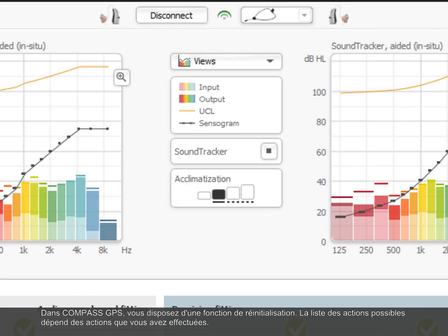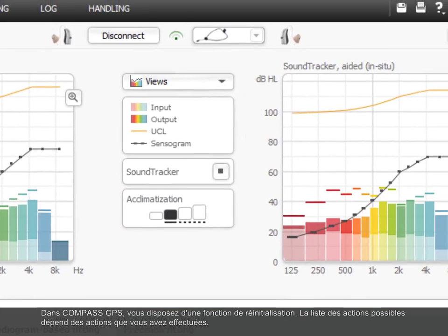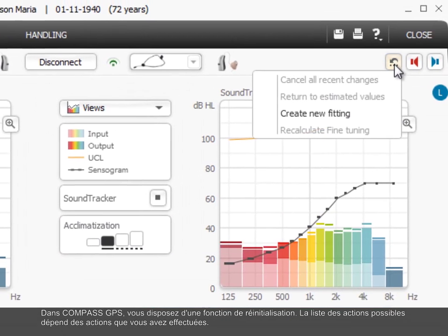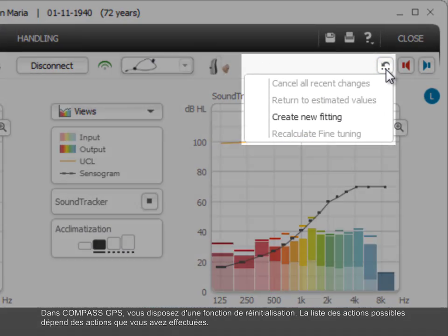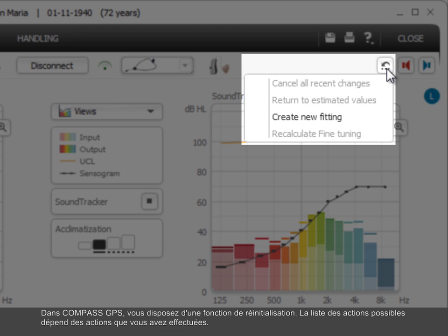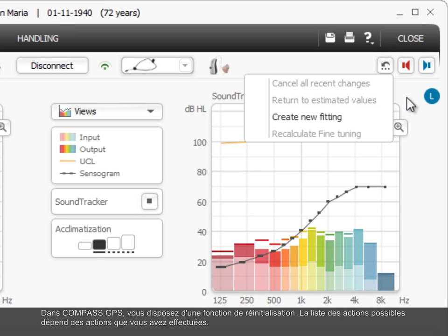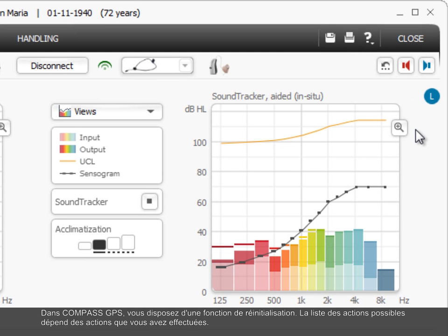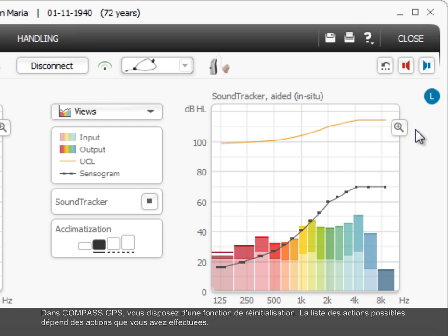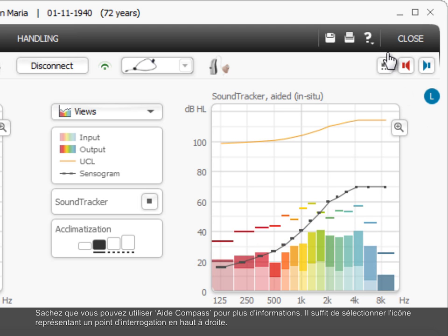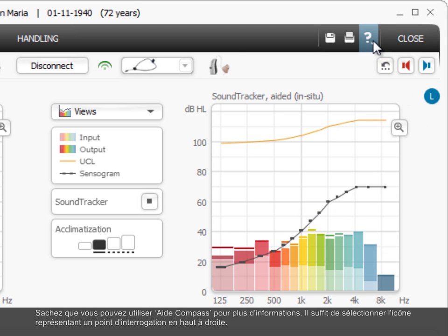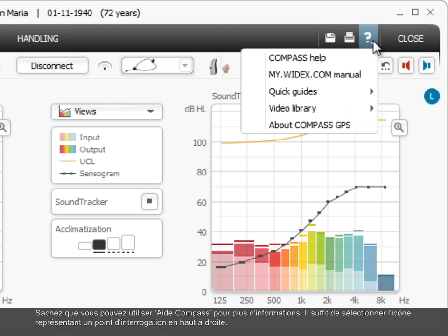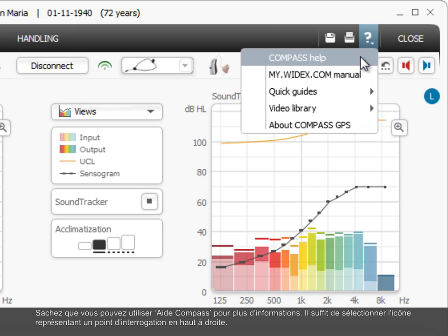In Compass GPS, a reset function is available. The list of possible actions depends on which actions you have performed. Remember, you can use Compass Help to get more information. Just select the question mark icon in the upper right corner.